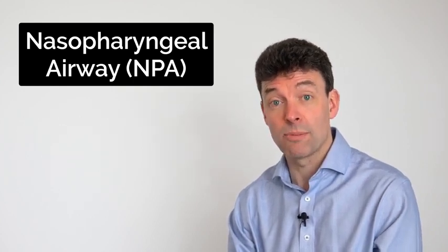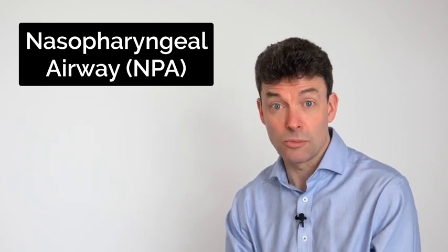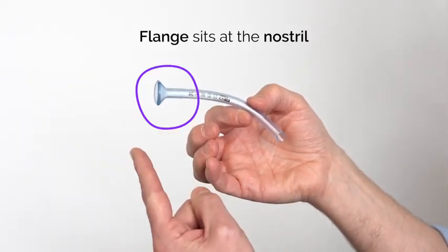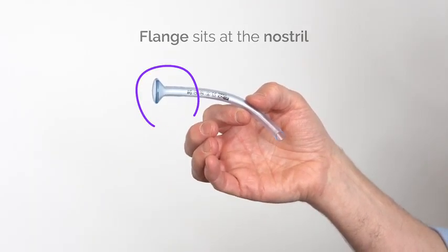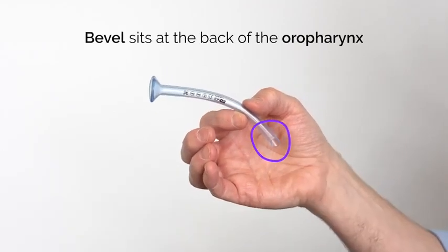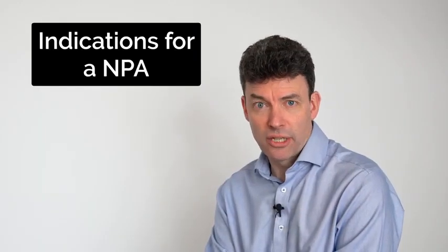I'm going to explain a bit about it, a bit about the indications for using it, and then I'm going to demonstrate on a model how we put it in. So this is the nasopharyngeal airway. It's essentially a tube that goes from the outside of the nose, this flange sits next to the nostril, and then the tube goes through the nasal airway, and the bevel at the bottom here sits just at the back of the oropharynx.